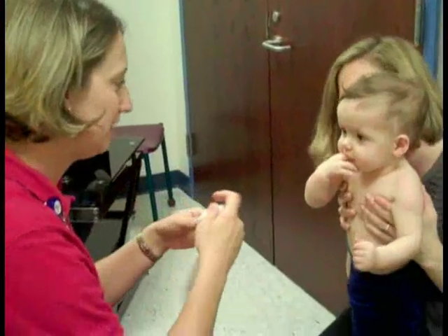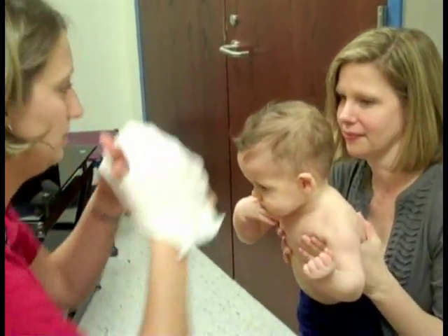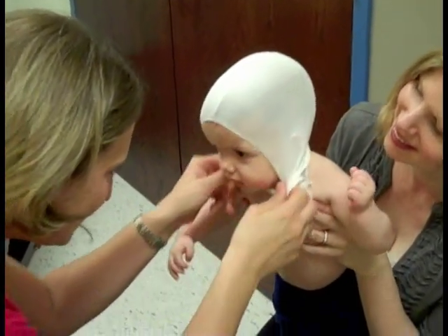I often tell parents that it's very similar to the scanner at the grocery store that scans your groceries. What we'll be doing is taking a stockinette and putting it over your child's head just to flatten out the hair so we can get a good look at the skull shape. Then we'll be laying the child in the scanner. The scan takes less than 2 seconds, so it's very fast.